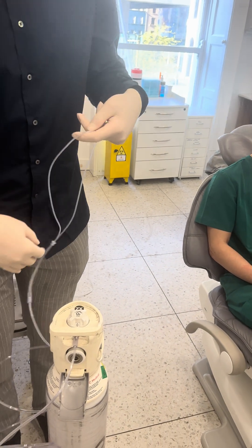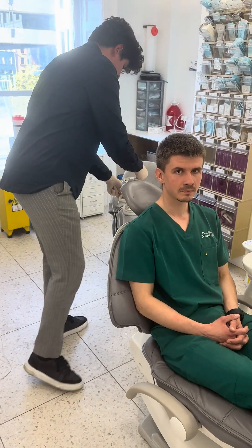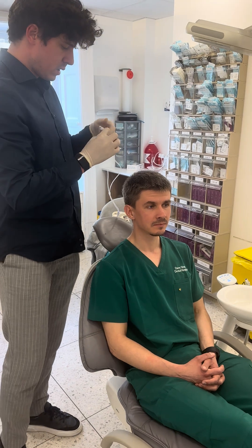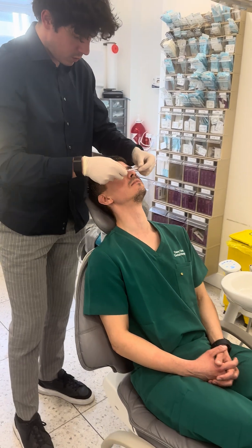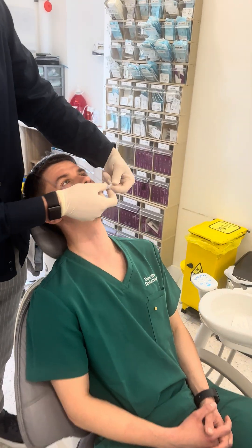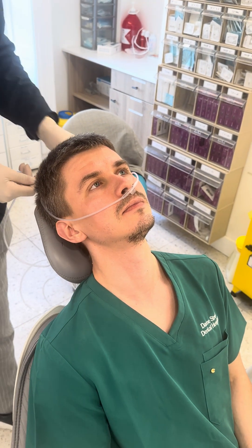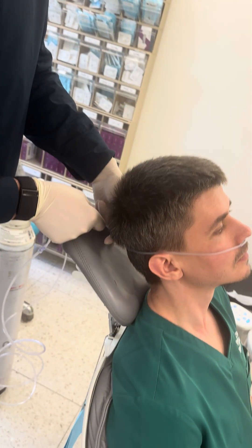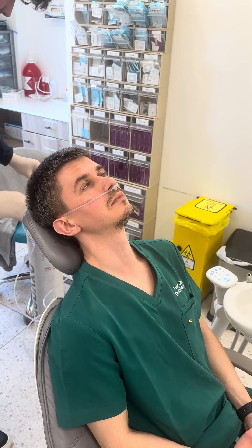It's got a tightening component here. By having this behind the patient during surgery — it can be quite far actually because it's a quite lengthy tube. Rest your head back. It's slightly curved, so the curved portion goes in there, although it doesn't really matter. Lift your head, and then we tighten at the back here. You've got to be reasonably tight, otherwise it's going to come out. Then we turn it on.